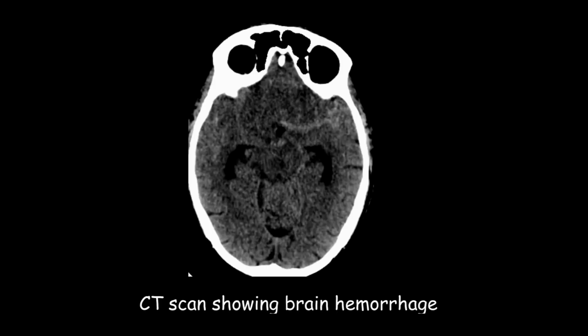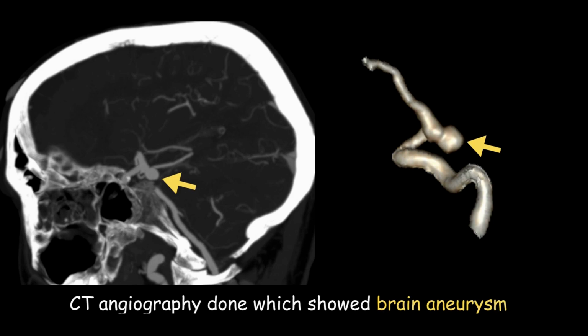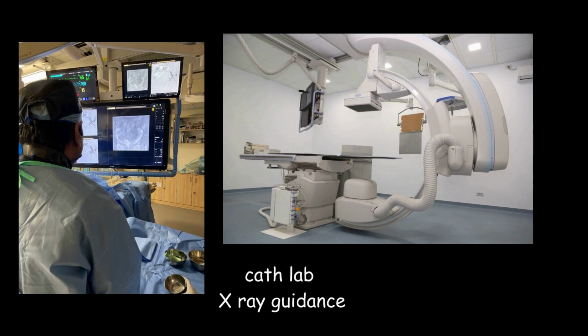CT scan was done which showed brain hemorrhage, or subarachnoid hemorrhage. CT angiography was done which showed a brain aneurysm in one of the blood vessels. The patient was taken for coiling in the cath lab under X-ray guidance.